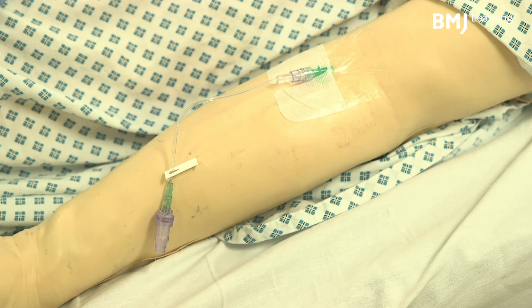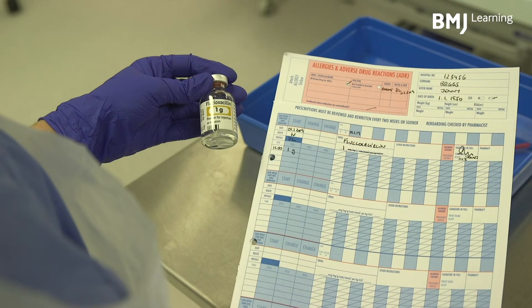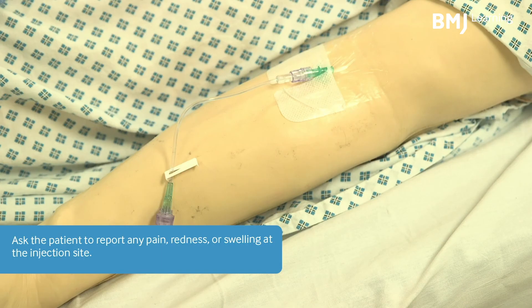Finally, secure the cap of the cannula. Sign the prescription to say you have administered the medicine and dispose of sharps and glass safely in a sharps bin. After giving an injectable medicine, ask the patient to report any pain, redness or swelling at the injection site.